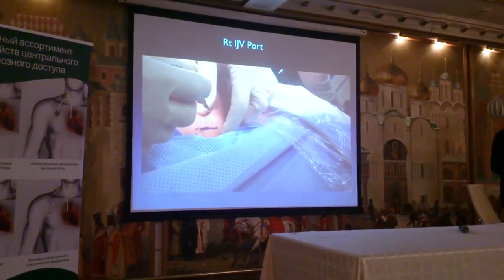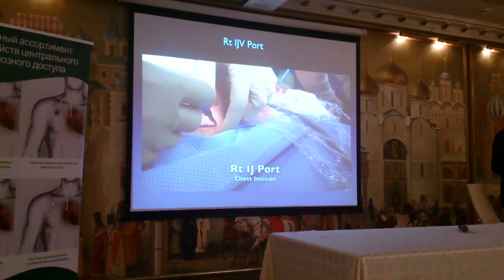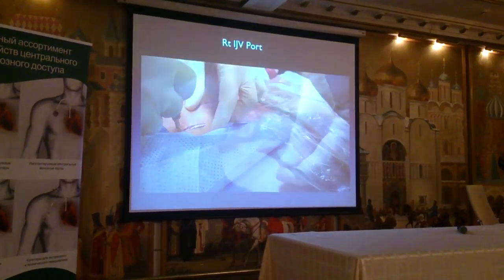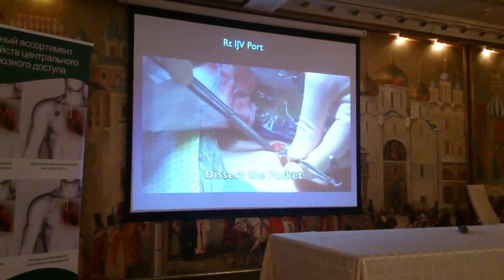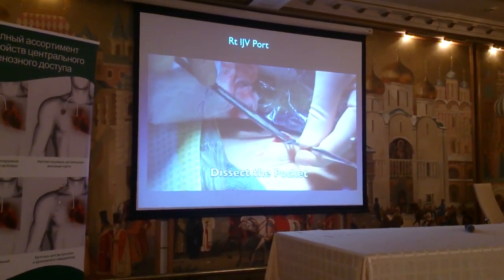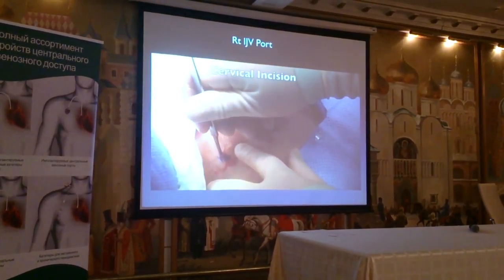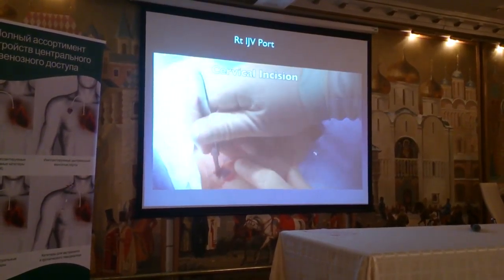Here is a right internal jugular vein port. Just like the last patient, we have to make two incisions and we have to tunnel the catheter between the two. I like to make the pocket first. I've assessed the vein and I believe I'm going to have a successful insertion, so I make my dissection.